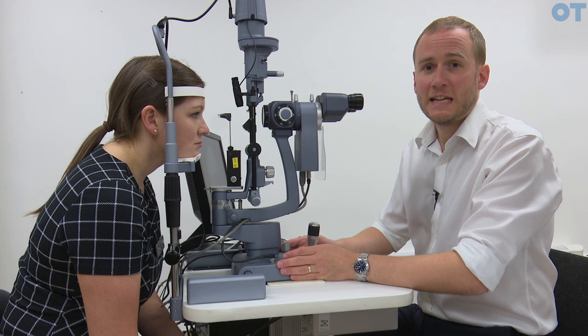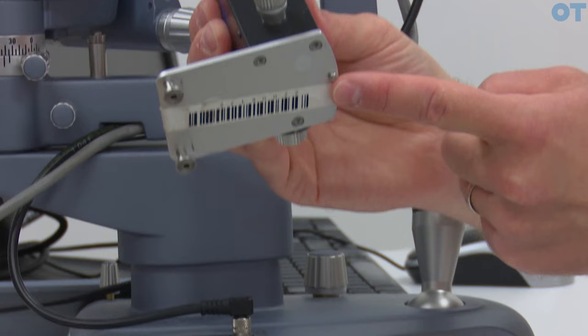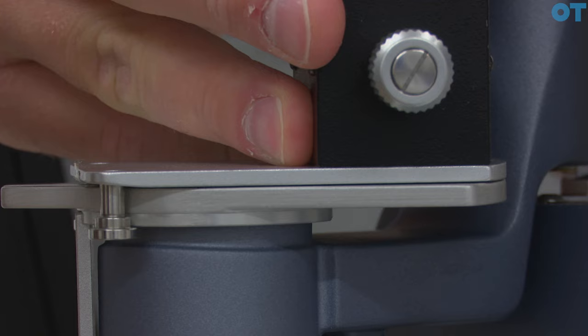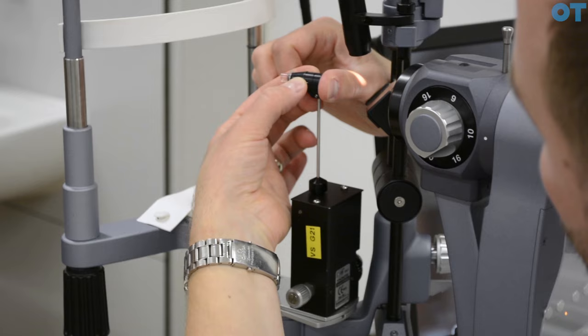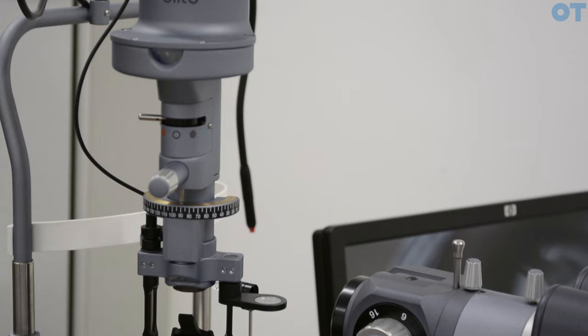The gold standard method of measuring intraocular pressure is Goldman applanation tonometry. We take the plate with the pointed side facing the patient and place it on the centre of rotation point, locking it into place. We then take the probe with this side facing the practitioner and place it onto the device, locked for either the right or left eyepiece. We insert the probe and make sure it is running horizontally by rotating until we can see that the prism inside is running horizontally.